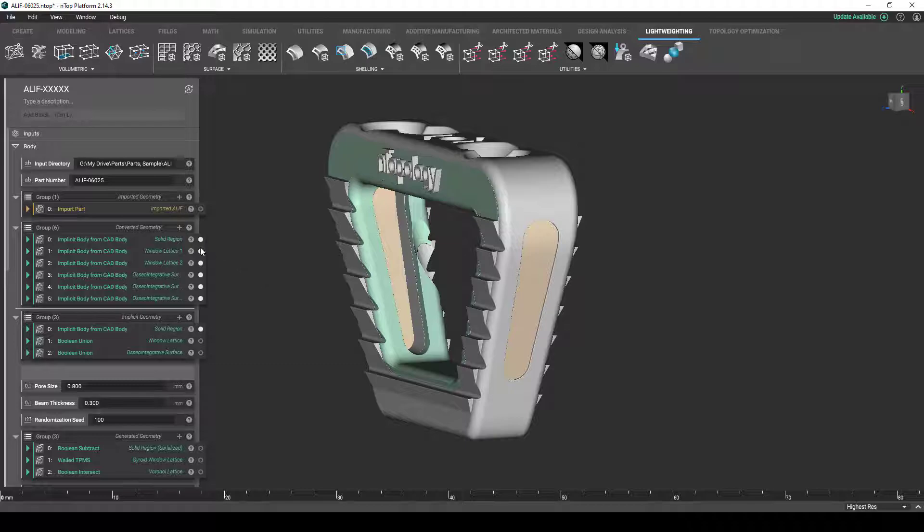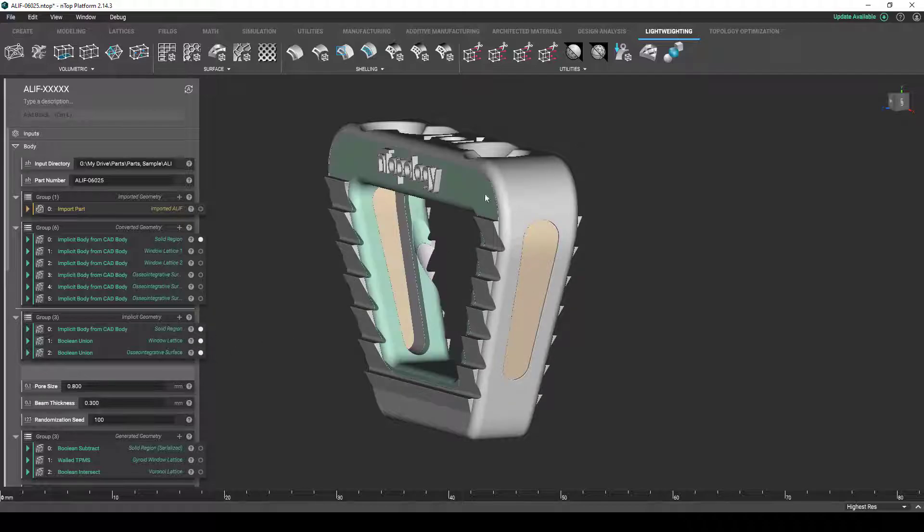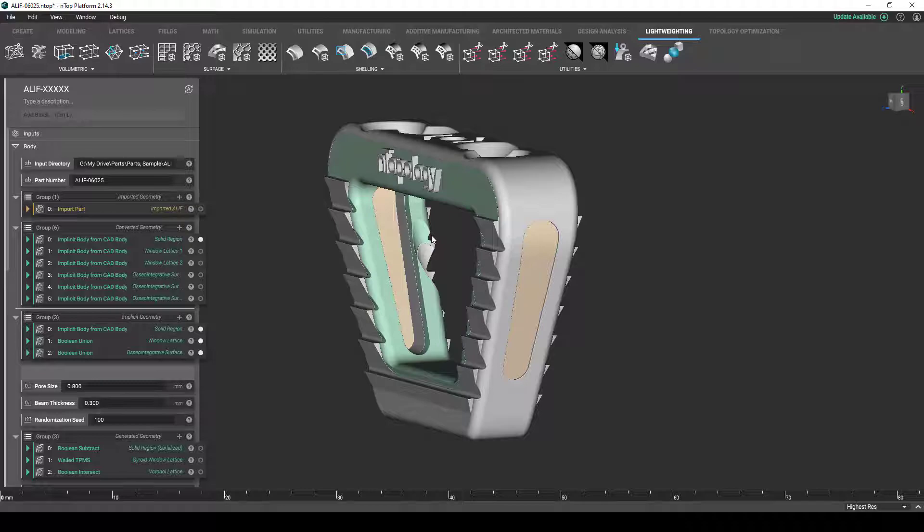So, if I hide all of these again, you can see that I can show the window lattices together and all of the internal osseo-integrative surface regions together as well. From there, we use these regions or volumes as the base to populate with our lattice structures.